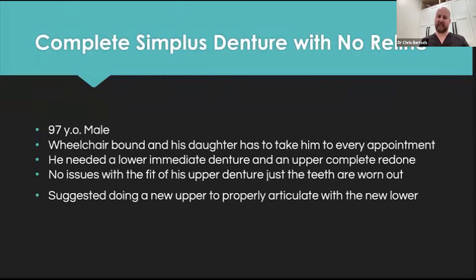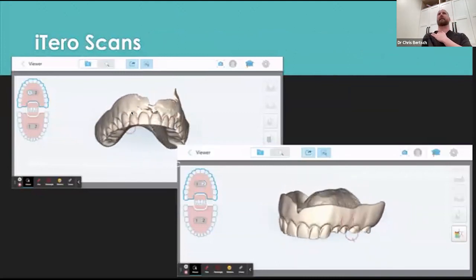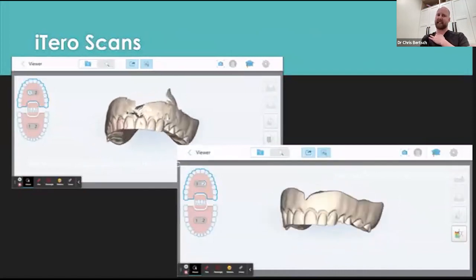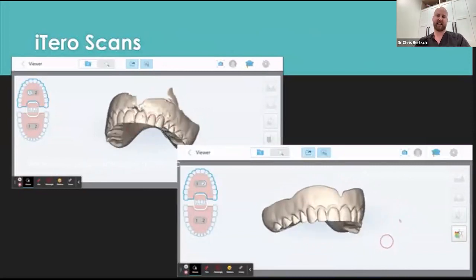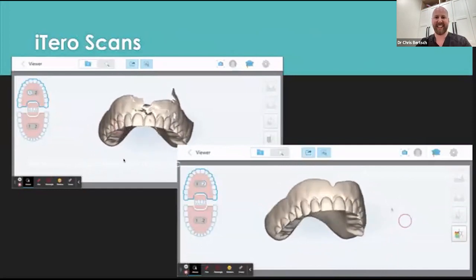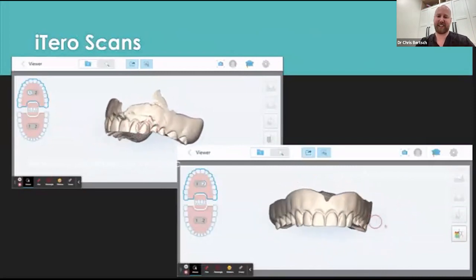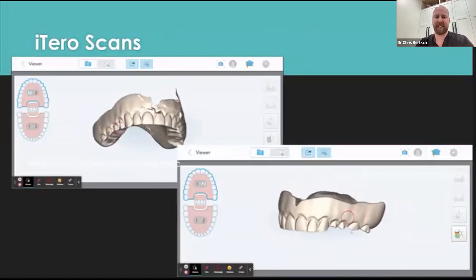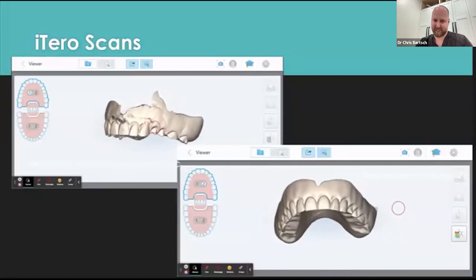So the assistant calls me, and with my dying breath, I explain how to do this over the phone to her. They're really good at scanning because we do a lot of Invisalign, but had never scanned dentures before. So I explained to her over the phone what to do, and this is what she does. On the top here, and this is going back to where I was talking about missing data and not all being stitched together, you can see the area that's missing right at the anterior of the denture. That is what we scanned. Oh, it's in white. You can't see it. Sorry. And then the bottom one is what iTero sends to the lab. So iTero is able to fill that in for a complete denture. So if that's what your scan looks like, stop stressing about it, send it. I've had massive success, and I feel like you will too.